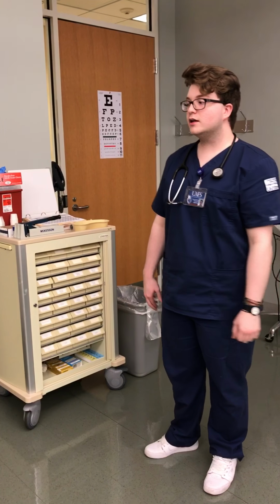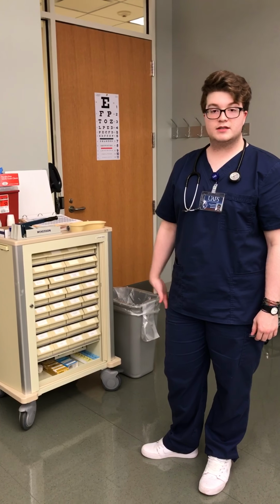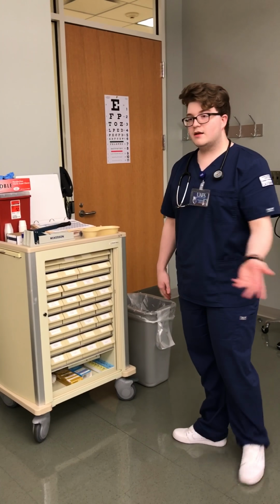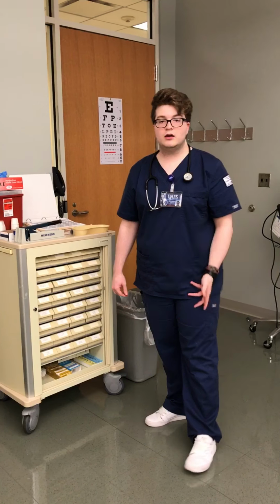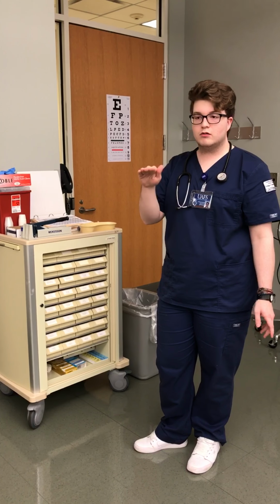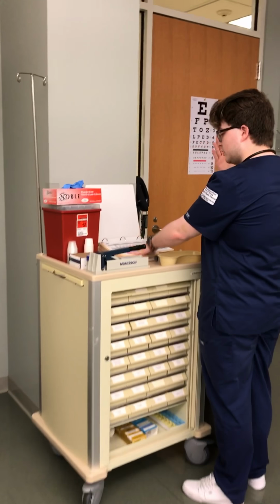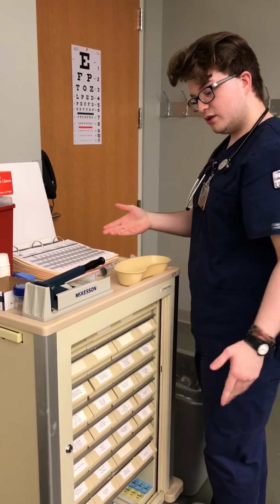Okay, so we're going to be doing medication administration through an NG tube. The first thing I would want to do is check my physician's order to make sure the medication was correct. And we'll say that that medication order was for 325 milligrams of acetaminophen, PRN, mixed with 15 milliliters of solution, just warm, like room temperature water. So I would want to check that order with my MAR, make sure that it looks correct, and if it was correct, I'd proceed with the procedure.